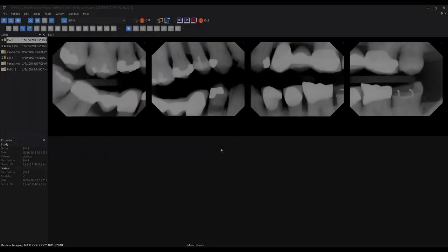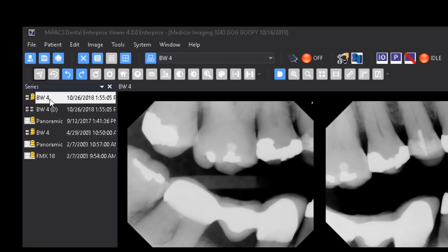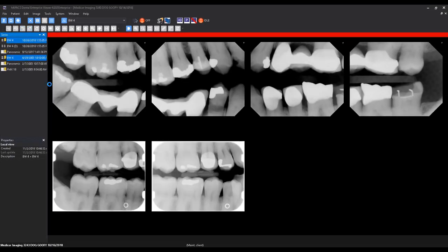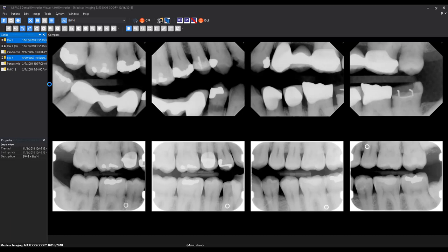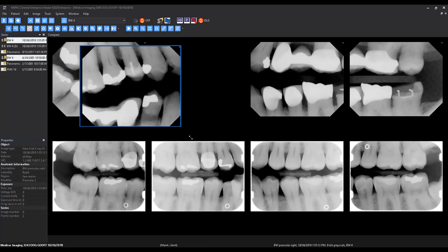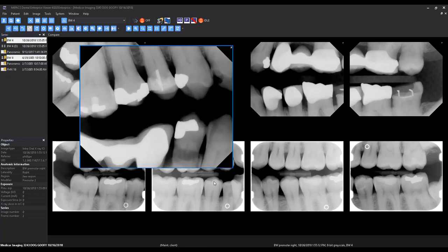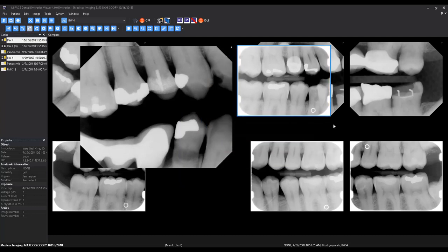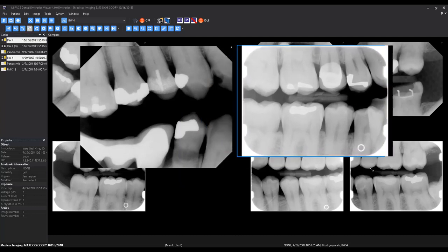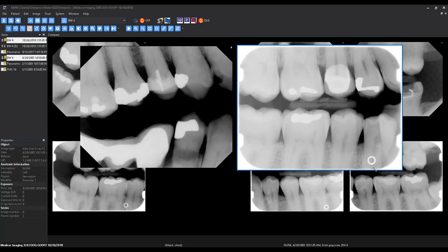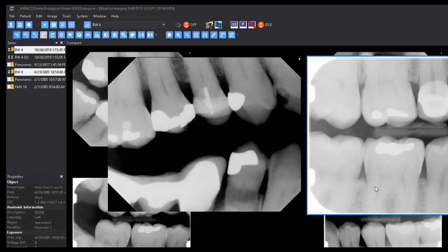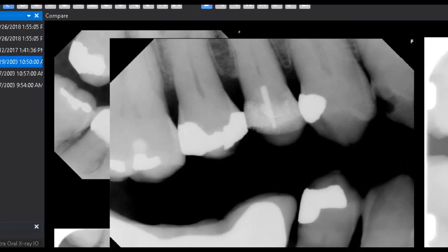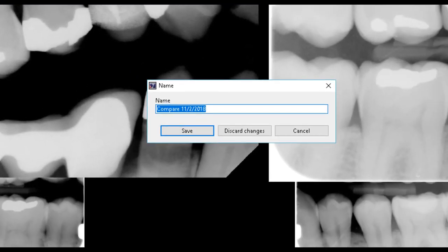You can also compare more than one series at once in the MyPax viewer. Simply hold down the Control key while left-clicking multiple series in the series view. As you select the series, they will start to appear in the Compare window. Within the Compare window, you can move and resize images freely. When exiting the Compare mode, the MyPax viewer will always prompt you to save the current view.